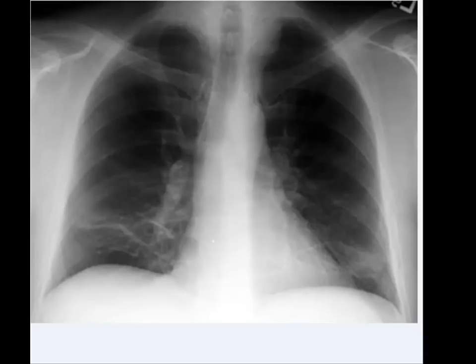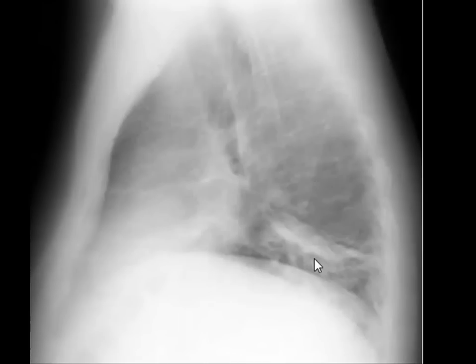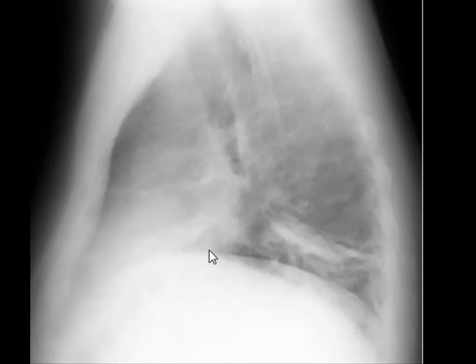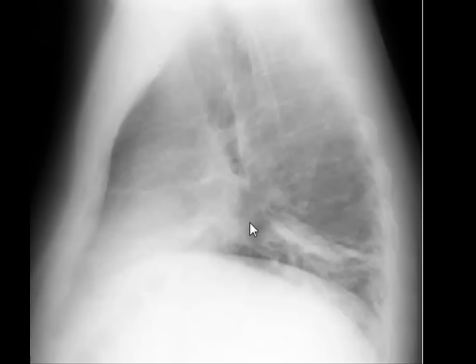On the lateral view you can clearly see that the atelectasis is in the right lower lobe. The oblique fissure runs like this and the horizontal fissure runs like this. This is right upper lobe, this is right lower lobe, and this is right middle lobe.